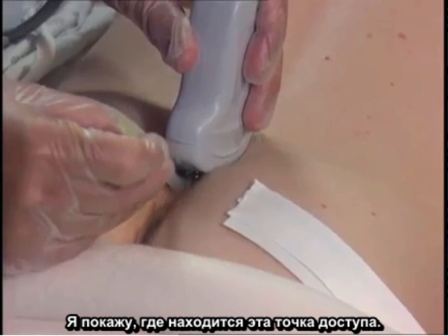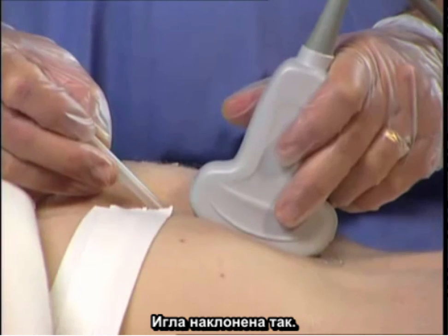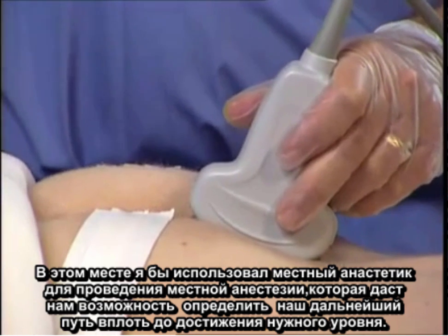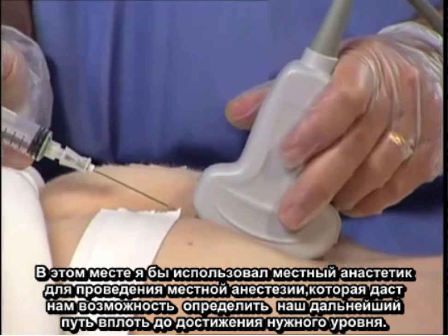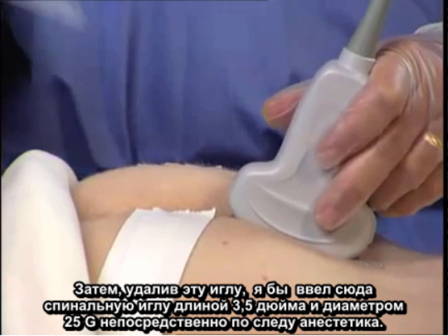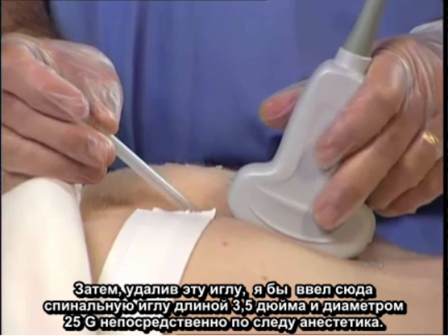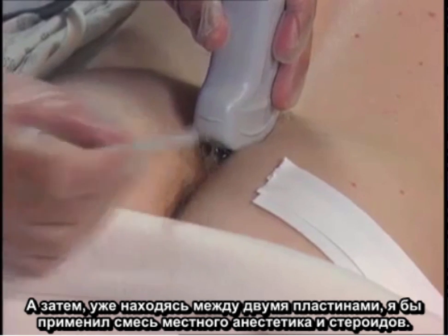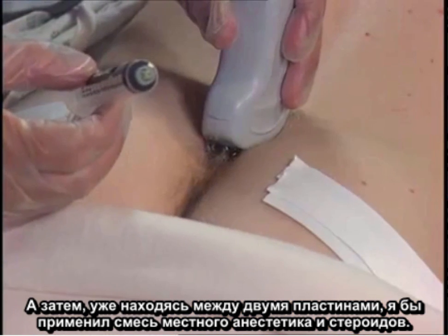I'll demonstrate where that access point is. The needle is angled thusly. At this point I would utilize the local anesthetic to perform a local anesthetic track down to this level. I would then place the 3.5-inch 25-gauge spinal needle along the same anesthetized track, and then once between the two plates, I would attach my local anesthetic and steroid mix.